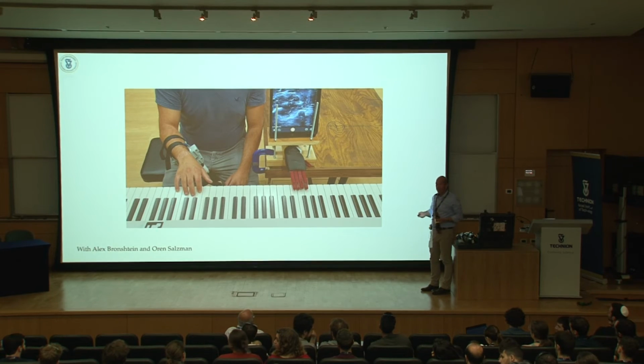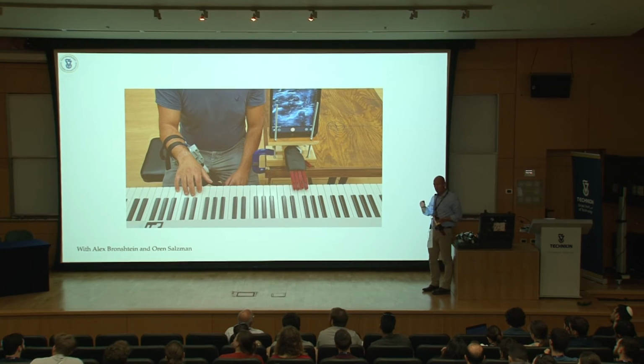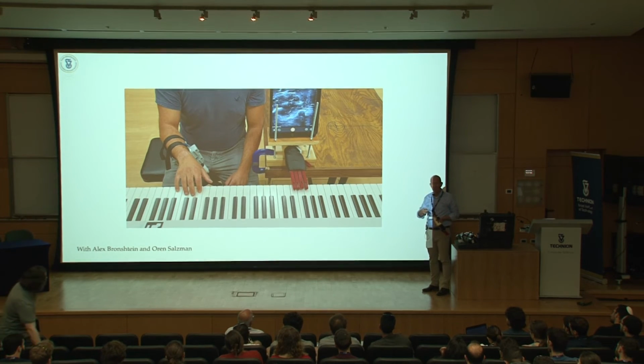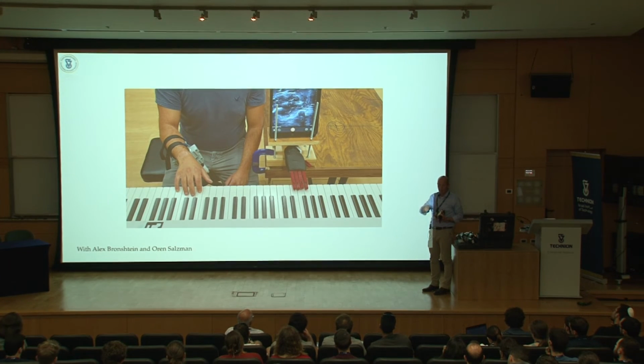And it's the first time ever in the world, I guess, Dean, that a robotic hand is operated with ultrasound, real-time ultrasound. So here is an ultrasound device, you see the image, the system learns with, again, deep learning, the motion of the muscles that you would see here, and then make the hand work and the dexterity, so we detect fingers, the intensity, and in real time.